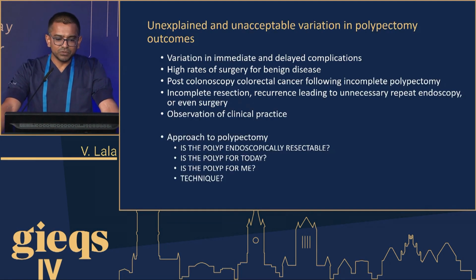So why the need to do this? The need is because there is quite a large variation in terms of outcomes as well as adverse events in polypectomy. And this results in unnecessary treatment and over-treatment for lots of patients. It may result in high rates of surgery for benign disease, post-colonoscopy colorectal cancer, incompletely resected polyps, multiple procedures, unnecessary surgery, or even repeat procedures for incompletely removed polyps.